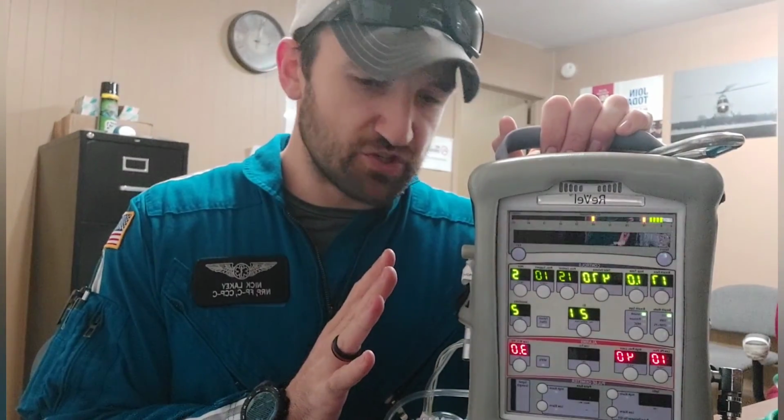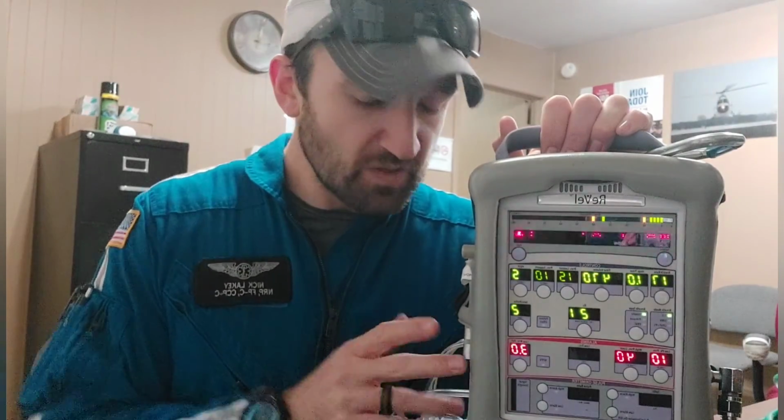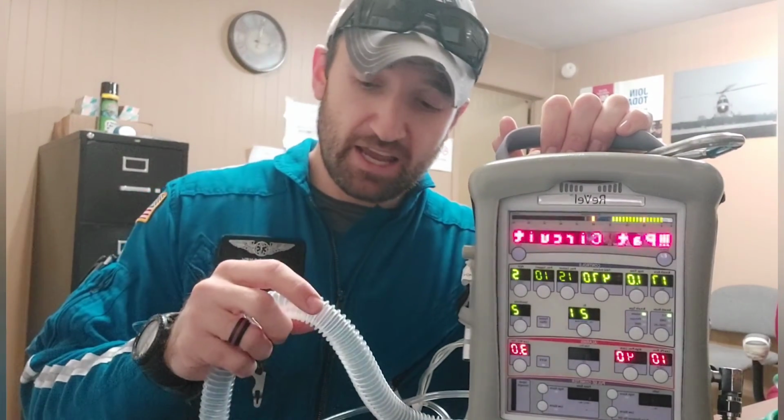I'm going to make sure that there's no cracks in the circuit, and you can see this would be pretty easy if it were to get stepped on or smashed. This could break. It's corrugated, it's relatively tough, but out here in Iowa we work in some relatively cold environments, and I have seen these break in extreme cold temperatures, so it is a possibility.